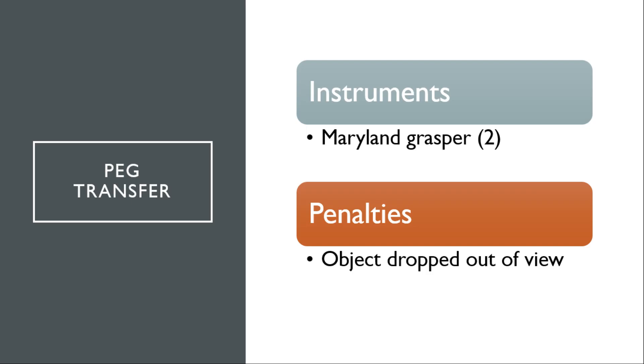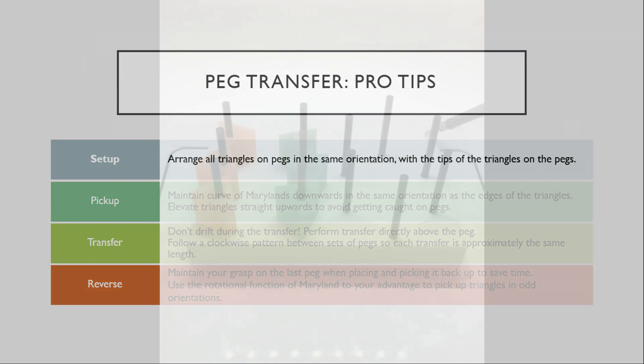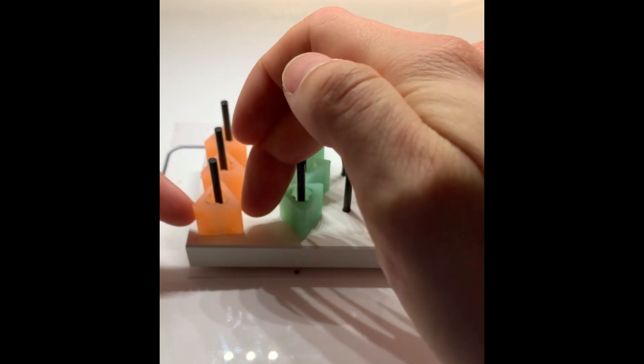For the PEG transfer, you will need two Maryland Graspers. A penalty will be assessed for an object dropped out of view. For the setup, you are allowed to arrange all triangles on the PEGs in the same orientation. As you can see here, the tips of the triangles are at the tip of the PEG.